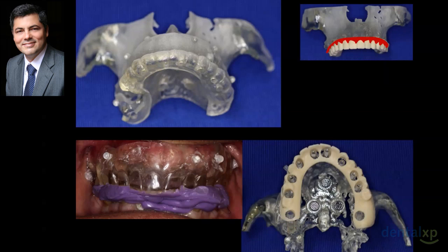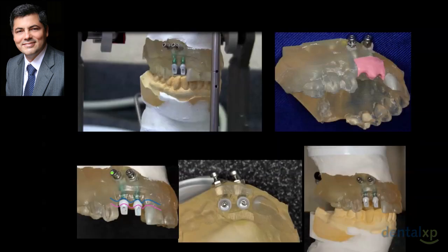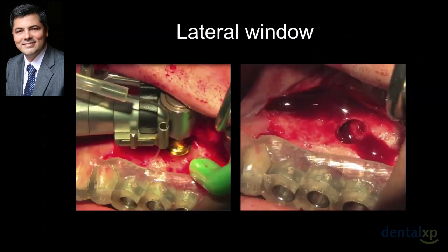And this is part of the armamentarium that we're utilizing now to be able to design an occlusion and get an idea in advance of how the patient is going to look, how the patient is going to feel with the new upcoming dental work. And this changes the whole equation, and it changes the whole game of how dentistry will be in practice.